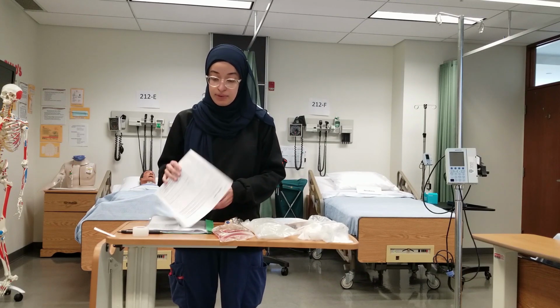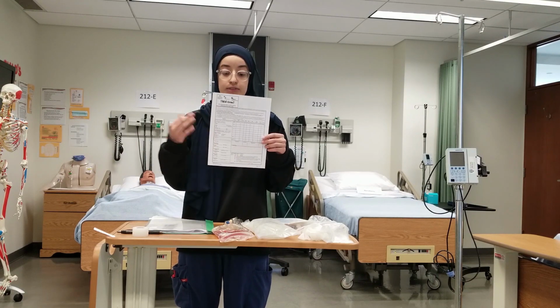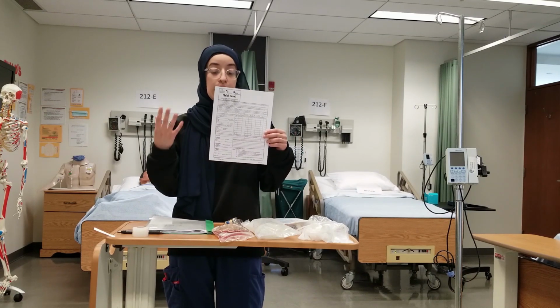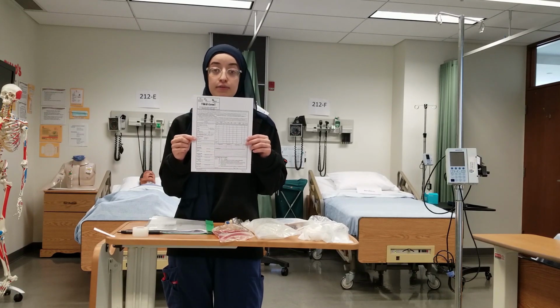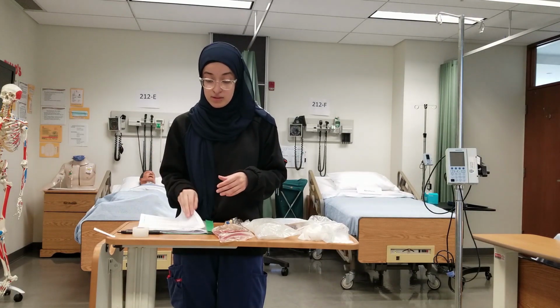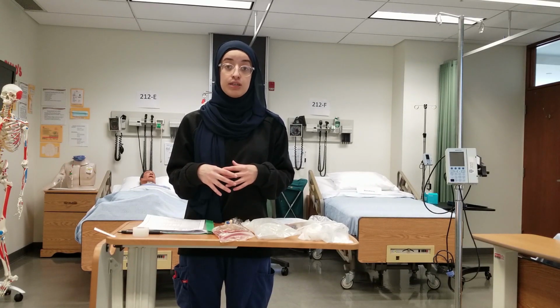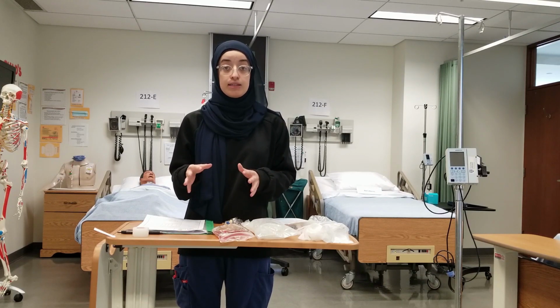Most importantly is your blood and blood components transfusion record. This gives you a lot of information about some of the expectations of you as a registered nurse when you're giving blood products and components to a patient. Most importantly is the fact that we need to take a lot of vitals. So you're going to be taking a preset of vitals. The reason we do this is to ensure that we're not putting the patient into fluid overload, or to be able to differentiate whether they're having a reaction to the blood products or if this is something that they've had before receiving this infusion.